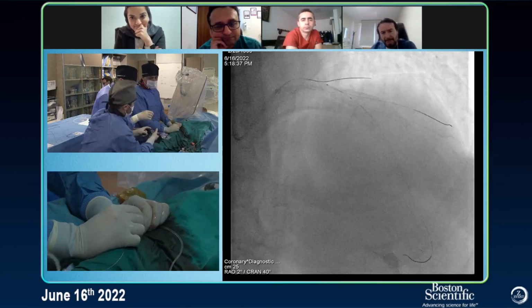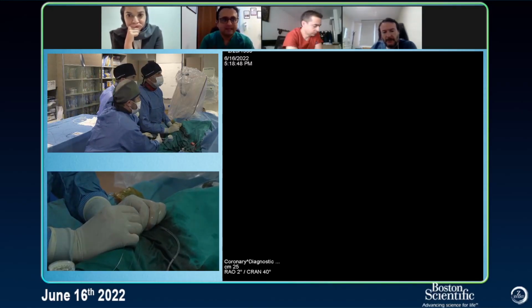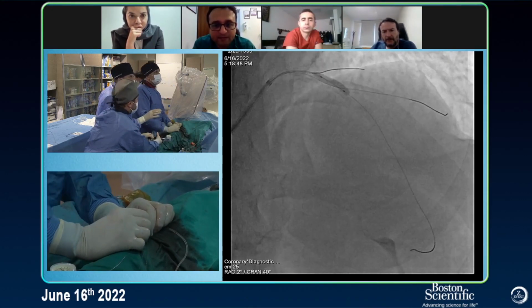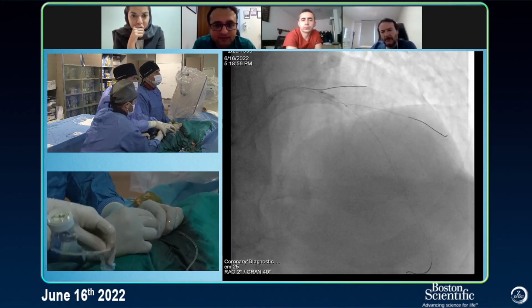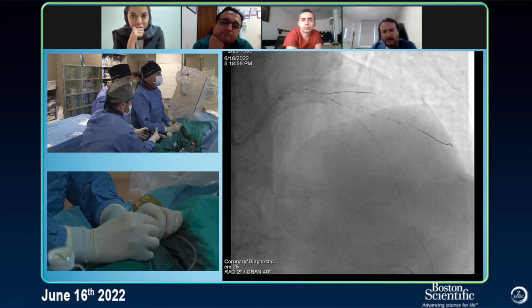Okay, go up here. This is, yeah, 14. This is 3.75? 3.75. 20, 24. Yes, enough. I think that's fine. Yeah, that's fine, guys. I don't know. We have some curve here. What do you think? Looks better. Looks acceptable, yeah. Much better. Go up. 20.